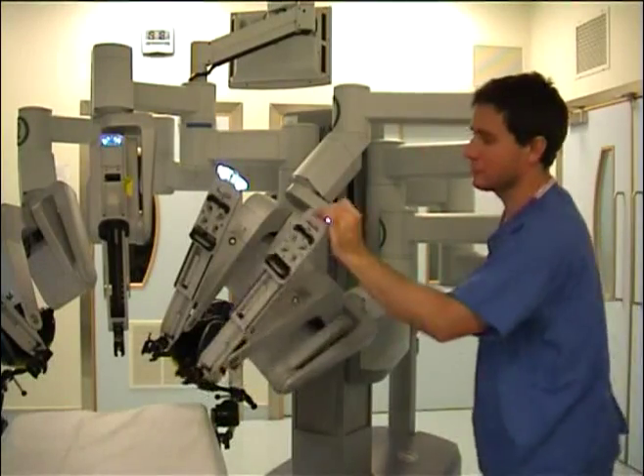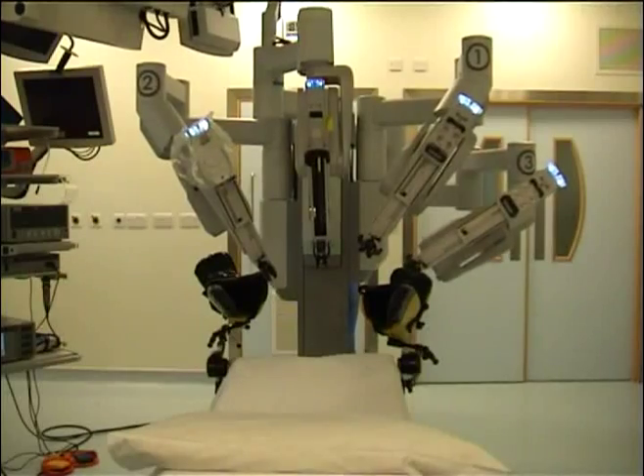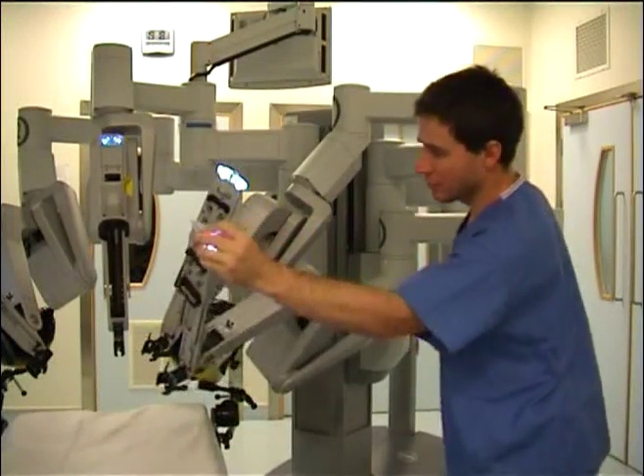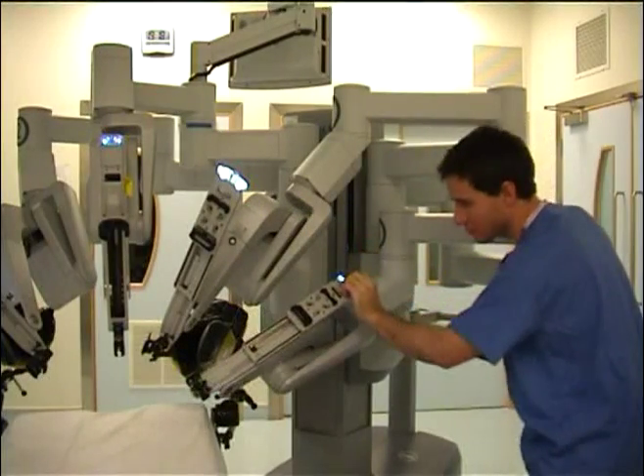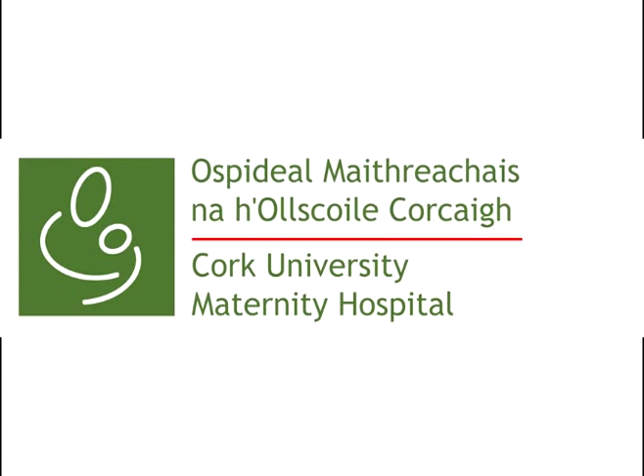If we look down from the patient head end and look at the position of the arms from the trocar to the first articulation joint, then the position of the arms is exactly the same for both the between-the-legs docking and side-docking approaches. We hope you have found this video informative. Enjoy your surgery.